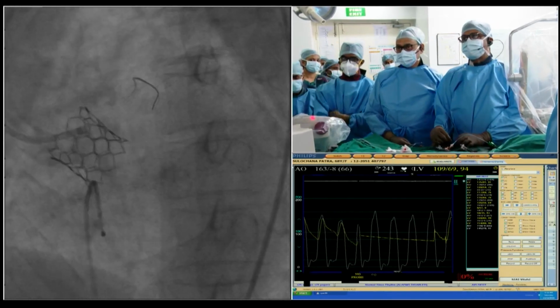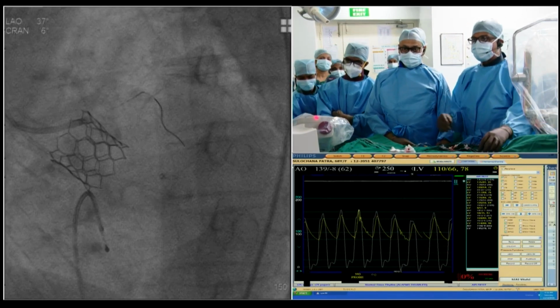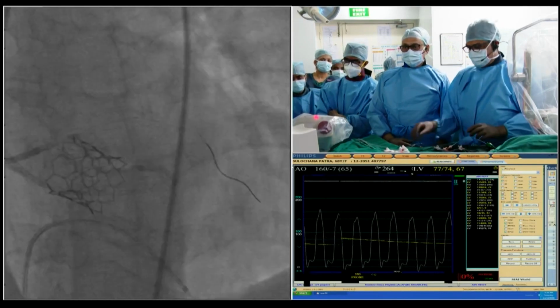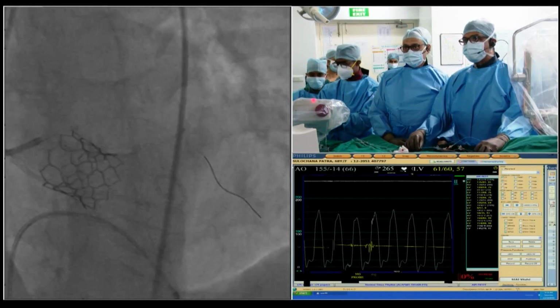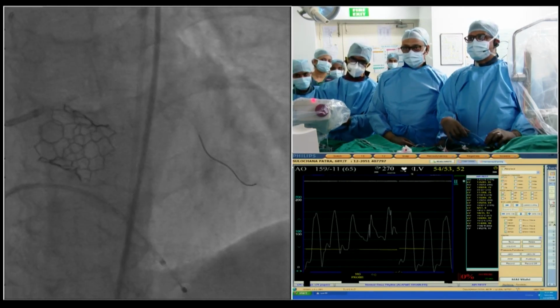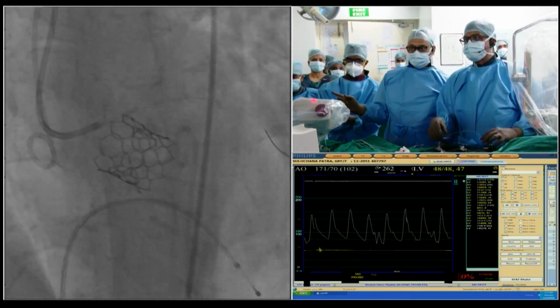Right, yeah. Go to PA coordination. So the hemodynamics part and the valve itself is very good. I'm not worried about that at all. I think it may be a good idea to do an IVUS. It may be good to do, even if you do an IVUS, because sometimes the leaflet may be dynamic. Once you have a wire and a guide liner or an IVUS catheter in place, it will not abut the vessel, it will not close the vessel. But once it comes out, it may. Yes, this is exactly what has happened. The leaflet is already on the left main, and only the upper part of the left main is filling the lumen. So I think the best way is to just stent it.